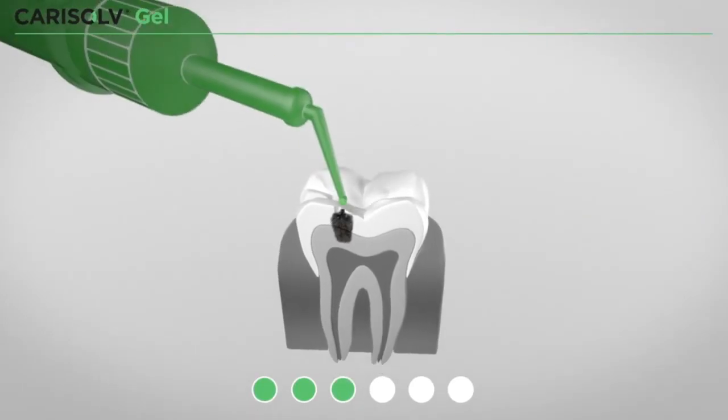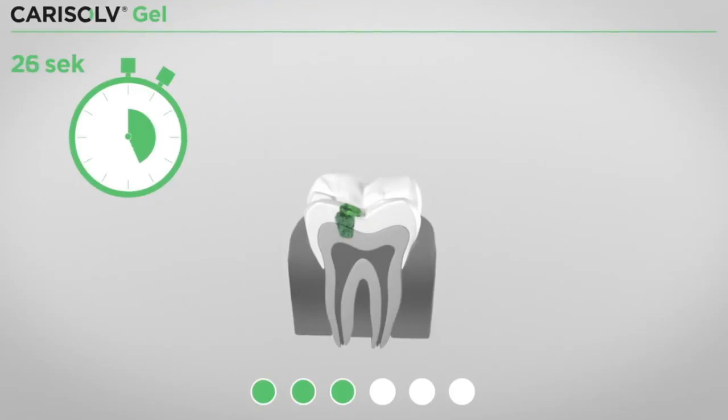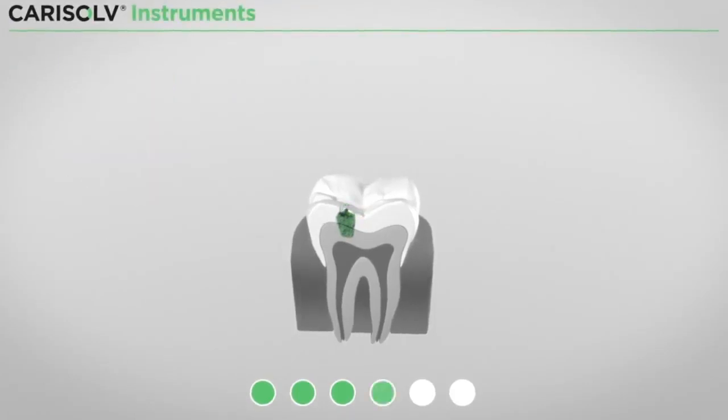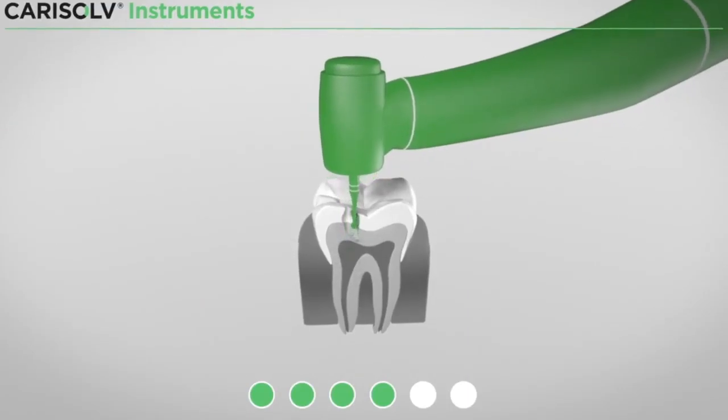CariSolve gel is applied in the cavity and the caries dentin is softened after 30 seconds. Now the softened caries tooth tissue can be removed easily with a tissue-protecting drill or hand excavator.